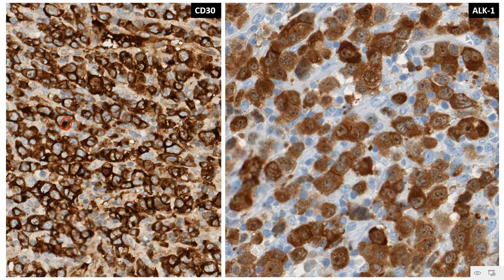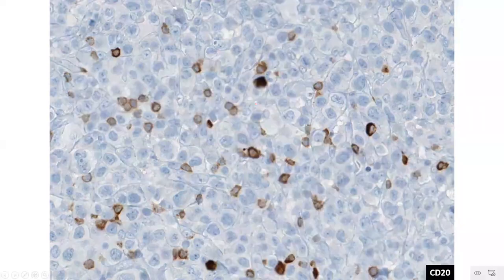In fact, there's a standing dictum that if you have a very diffuse, strong expression of CD30 in your atypical tumor cell population, anaplastic large cell lymphoma is an important suspect. Because even those cases of anaplastic large cell lymphoma which are negative for ALK will express the diffuse, strong CD30 membrane and Golgi zone positivity. In this particular case, we were lucky because ALK IHC showed a granular cytoplasmic positivity. So this looks like one of those variant ALK translocations, which is associated with a strong cytoplasmic rather than a combined cytoplasmic as well as nuclear positivity for ALK.